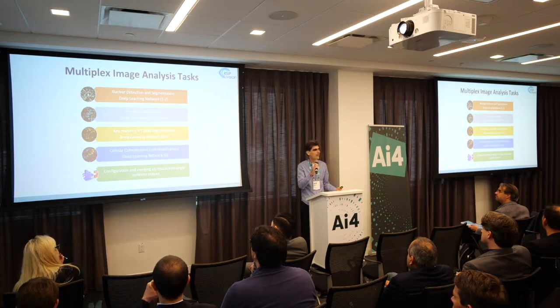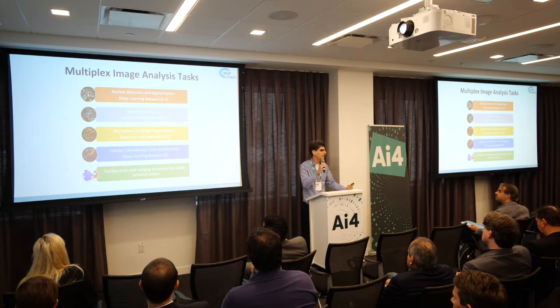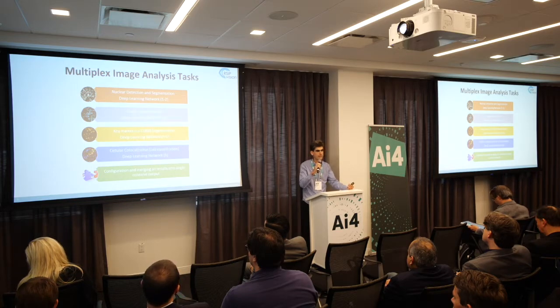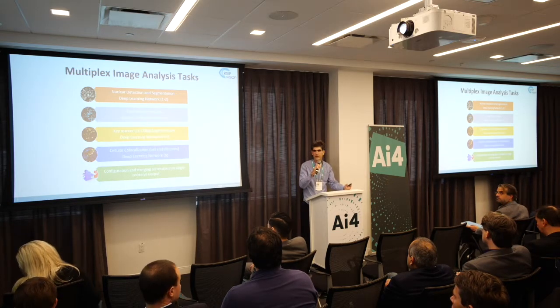We want to do it the way pathologists do it, not only with predetermined thresholds on the responses in different channels, but rather build a more general purpose, more scalable system that can tackle more difficult tasks. And then afterwards, you want to merge all the different results into a single cohesive output, to be able to tabulate the results and use them for research and so forth.